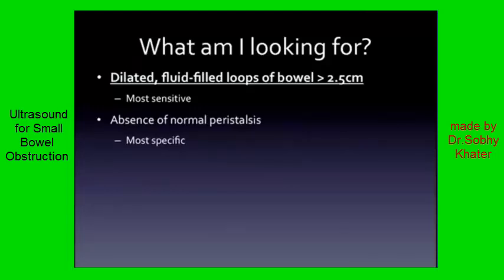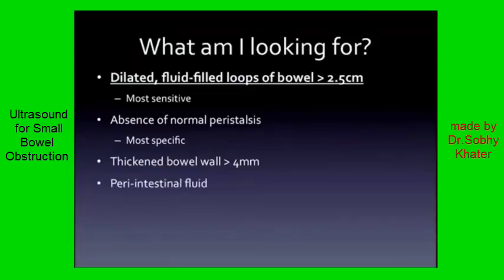Look for the absence of normal peristalsis — either none altogether or an abnormal back-and-forth, ineffective motion. Some studies argue this is the most specific sign. We'll look at a clip of this in a second. Look at the bowel wall: it's going to be thick. An angry, distended bowel is going to be thick, and the measurement we use here is four millimeters. Peri-intestinal fluid — you saw that free fluid around the bowel in our last shot — that's also a sign of obstruction.